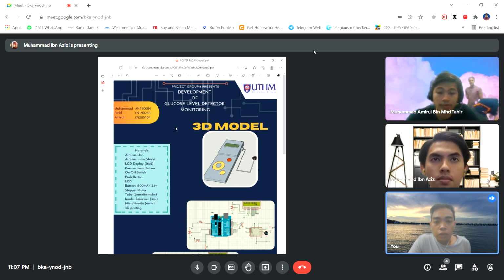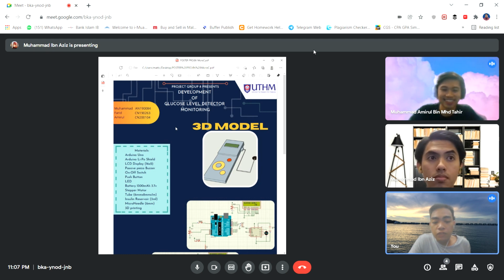Okay, today we want to discuss our project, which is a development of glucose level monitoring. The title of this project is, we choose to develop a glucose level monitoring in the body, which can dispense doses of insulin.